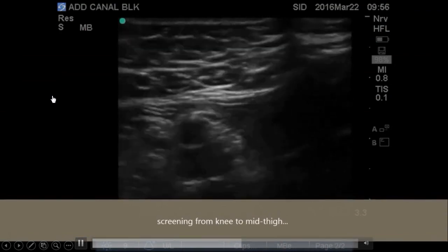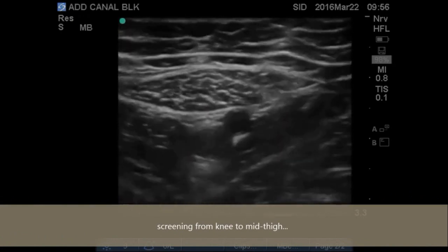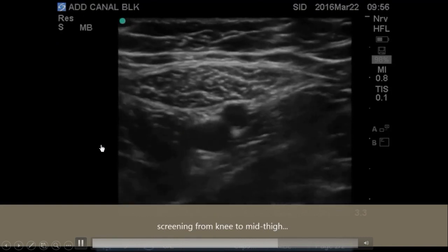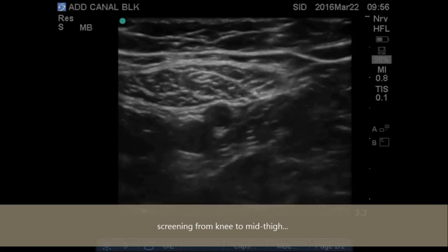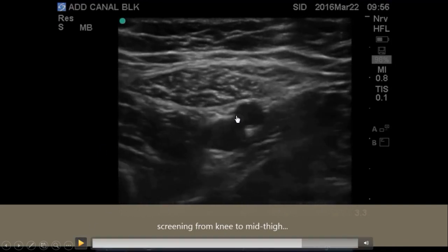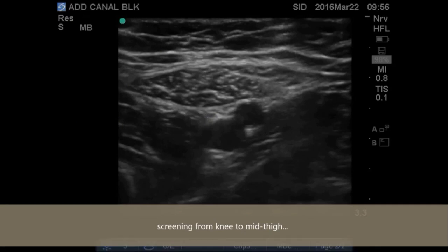Scanning from the knee up to the mid-thigh, the sartorius is seen covering the canal proximally. The C point and B point are identified, and local anesthetic is to be deposited at point B. The femoral vein is compressible while the artery is not. Just beyond the vasoadductor membrane, the drug is instilled. I generally use a lateral-to-medial approach, depositing 5 to 10 ml for low dose or 20 to 30 ml for high dose.